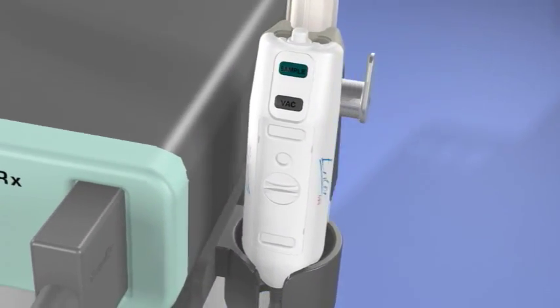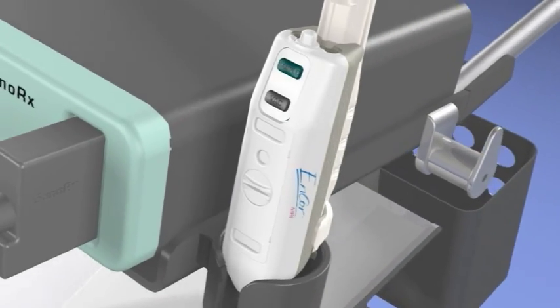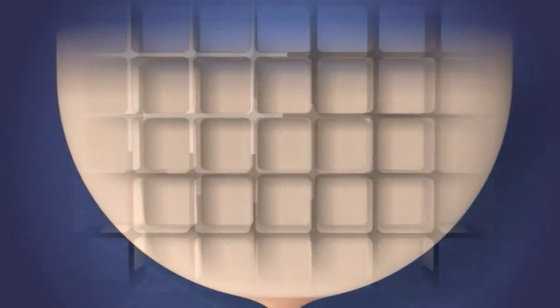It minimizes the duration of the procedure while maximizing patient care. With the region of interest identified on the diagnostic MRI, the breast is stabilized in the well of the coil. With mild compression applied, the surface of the breast tissue should pillow between the fenestrations of the interventional grid.